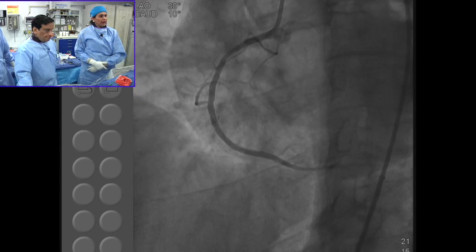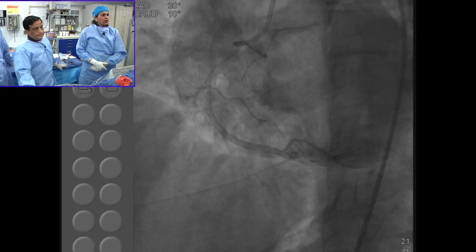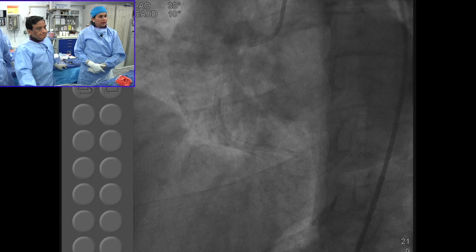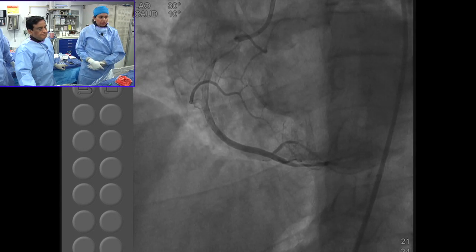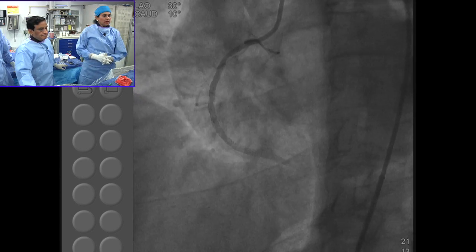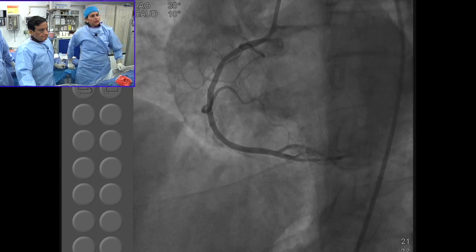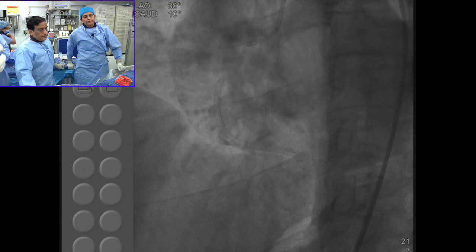So once you are done with pre-dilation and you know your pre-dilation is good, again, if there is calcium, you may have to go with another non-compliant balloon and pre-dilate. Otherwise, if you have been able to deliver the balloon and dilate it, you can just stent and come out. The key few steps are: if the transit catheter crosses, go with the 2.5 balloon, pre-dilate, stent, and come out, and that could make your CTO very short, with a decreased amount of radiation as well as less dye.